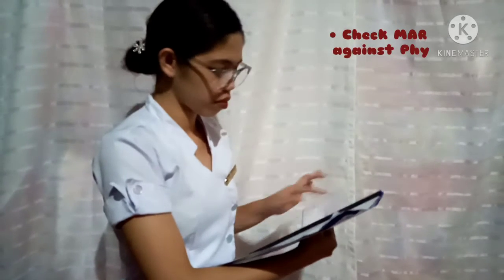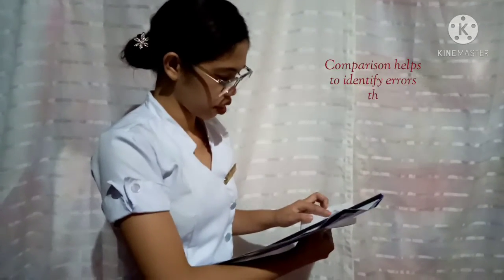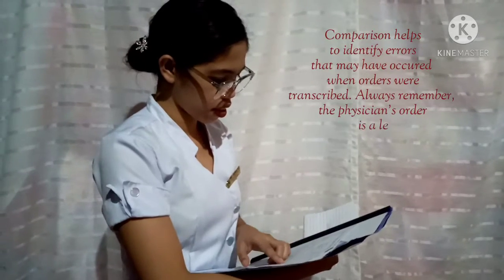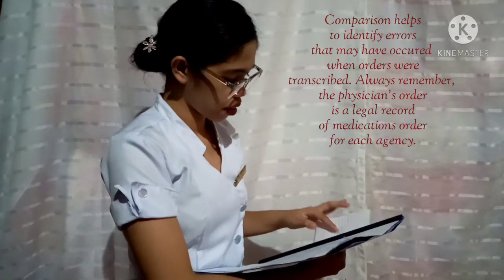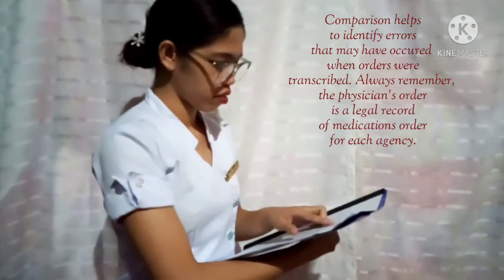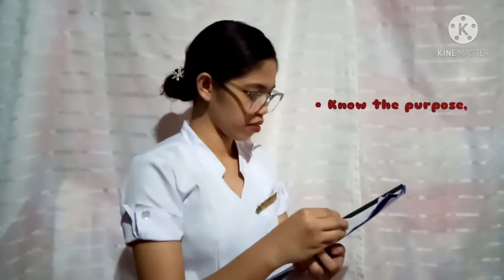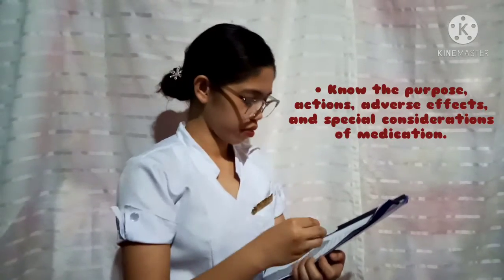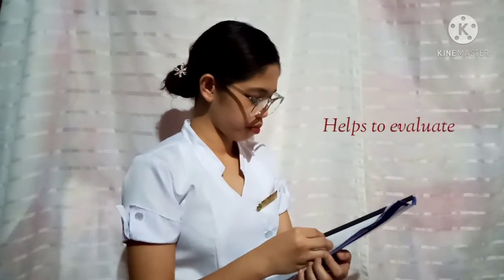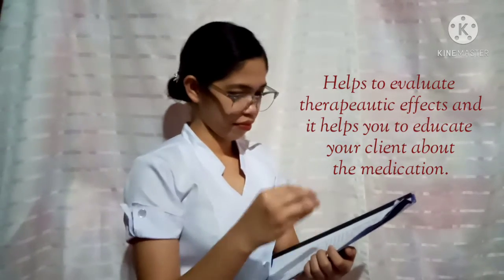Check the medication administration order against the physician's order. Comparison helps to identify errors that may have occurred when orders were transcribed. Always remember that the physician's order is a legal record of medication orders for each agency. Know the purpose, actions, adverse effects, and special considerations of the medication to be given to the client. This helps to evaluate therapeutic effects and helps you to educate your client about the medication.